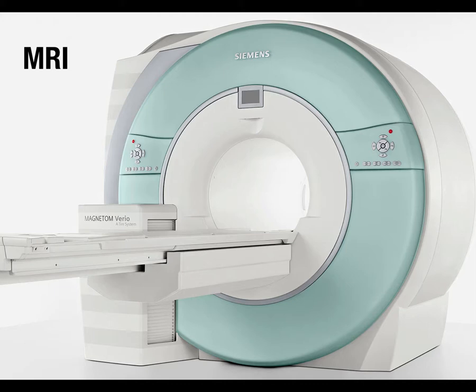And the walls of the MRI scanner room are typically on or past that 5 Gauss line, meaning that you've basically created physical walls around the scanner that keep the dangerous magnetic field inside that room, and then you control access to the room as a means of safety. The room's also a big Faraday cage.